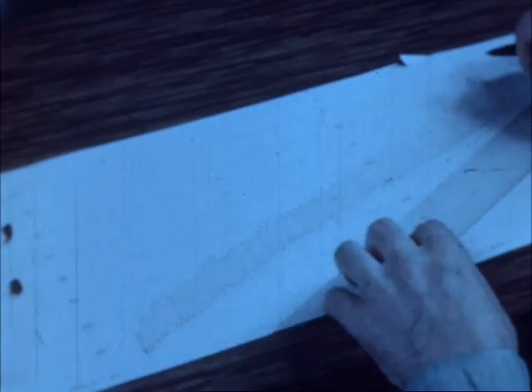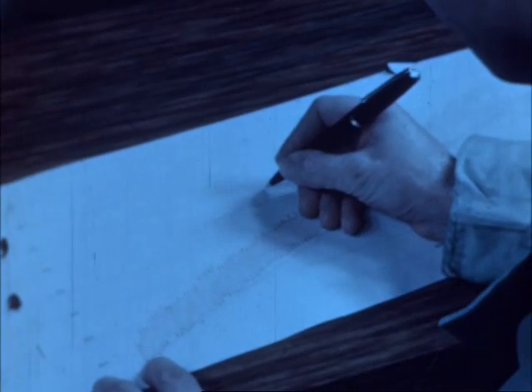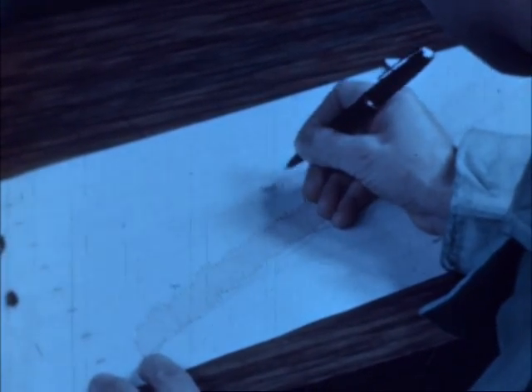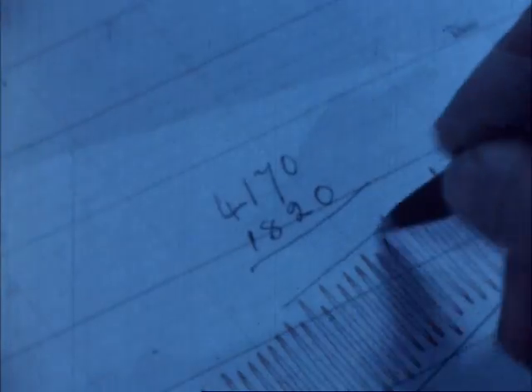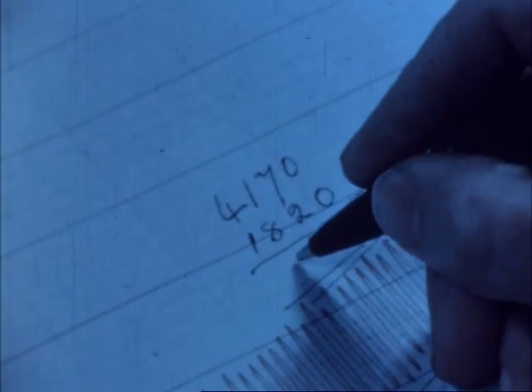A line is ruled corresponding exactly to the slope of the tracing. 10 minutes are counted and the scale volumes are read at the beginning and end of this period. The difference is the volume of oxygen consumed in 10 minutes. Hence, oxygen consumption by this individual in a minute is 235 cubic centimeters.